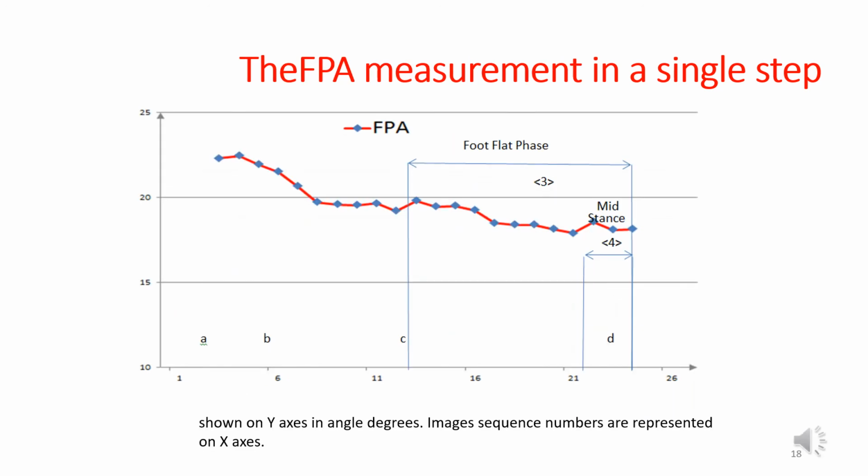During normal walking speed at point D, 4 or 5 pairs of foot progression angles were measured. Their average value will be taken as the foot progression angle of this step.